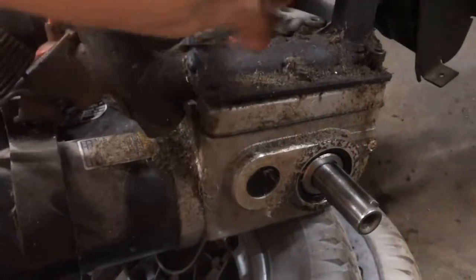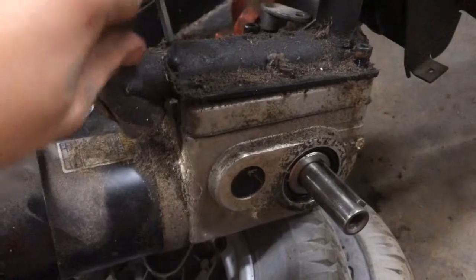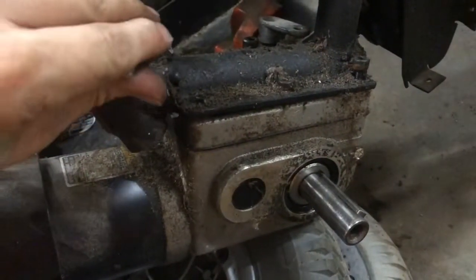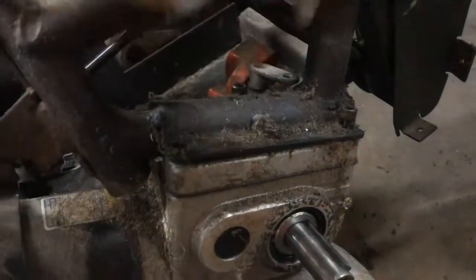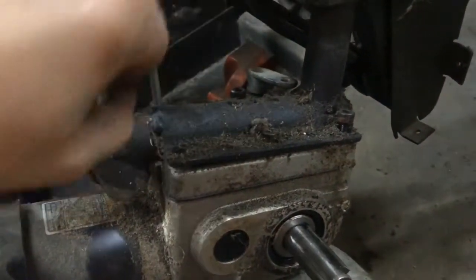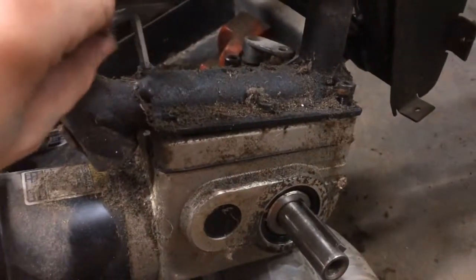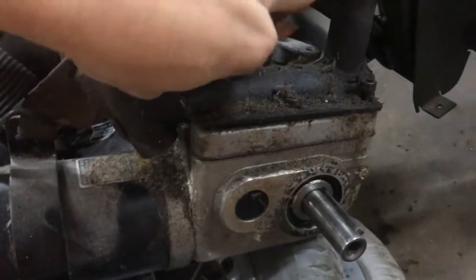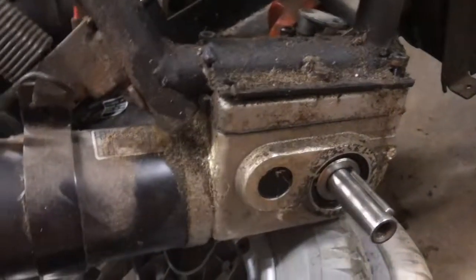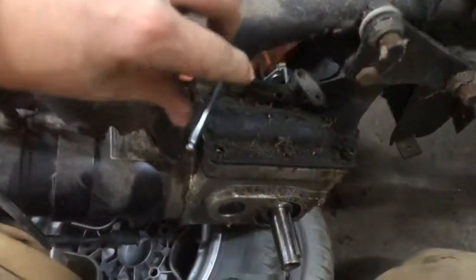This front one. Now when you start pulling it out, once they're loose, they should come out really easy. If it starts getting really tight, you want to make sure that the motor's level, because if it gets tight, that's telling me it's not coming out straight. So make sure you have the motor level or flush as much as possible, because there shouldn't be that much tension on it. I'm running into that problem. So, there we go.